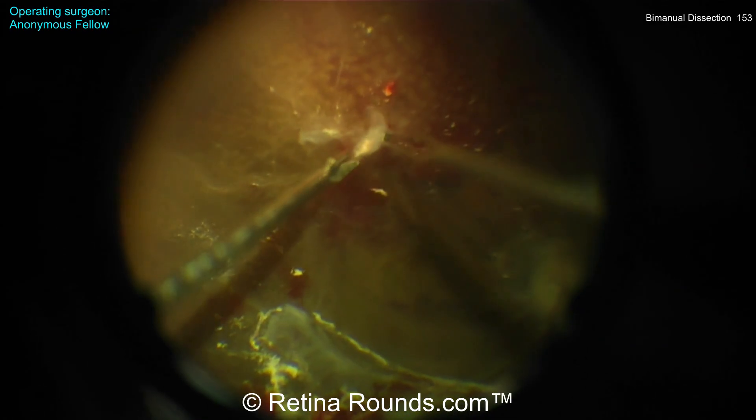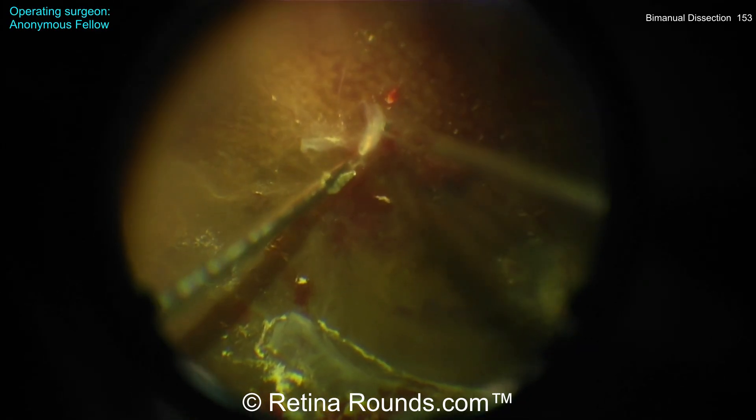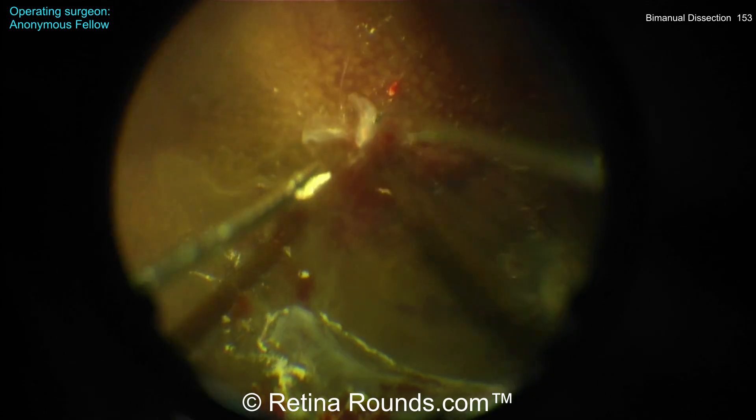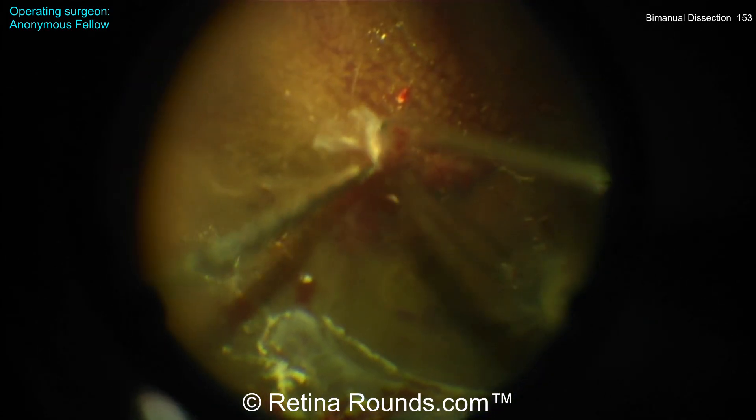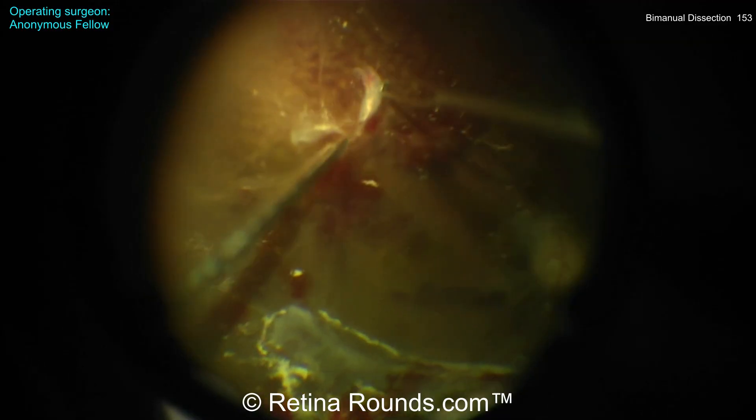Using the scissors, you want to bluntly dissect between fibrovascular pegs and then use the open scissors to actually cut the fibrovascular pegs right at the base, right where they emanate from the retinal surface.